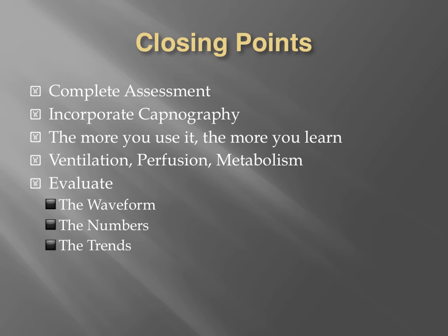Okay, ventilation, perfusion, metabolism. All three need to be present, and any one of the three or all of the above can affect your carbon dioxide readings. And let's remember that we need to evaluate not only the waveform, but we also need to evaluate the numbers, and we need to evaluate our trends over the course of time to see if the patient is the same, worse, or getting better.